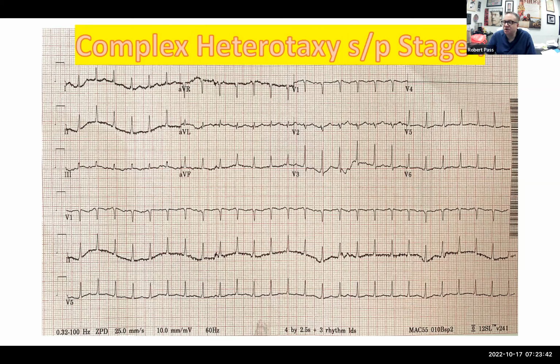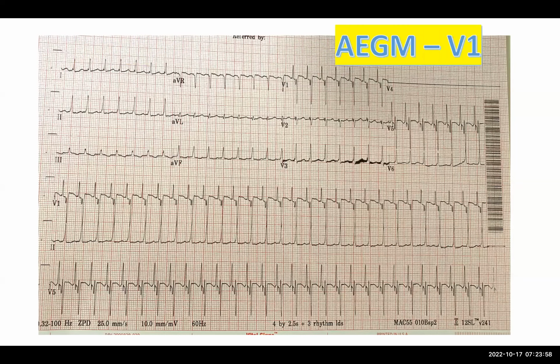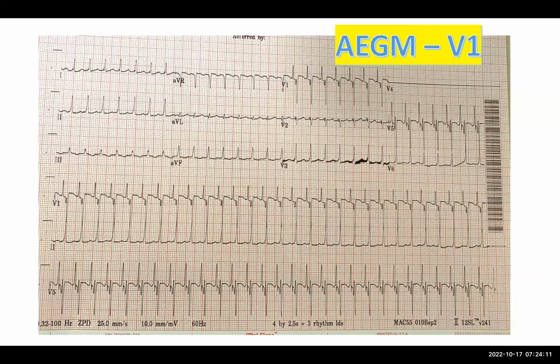Okay, that was a good choice. So one of your co-fellows who's on the line did just that. And here is that atrial electrogram. I believe it's on V1. So what do you think about that? So it looks like there's a P before every QRS with a regular PR interval. And I see the P waves maybe a bit better on this tracing. Does look upright in AVF.